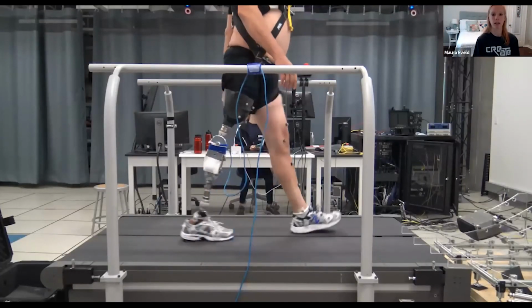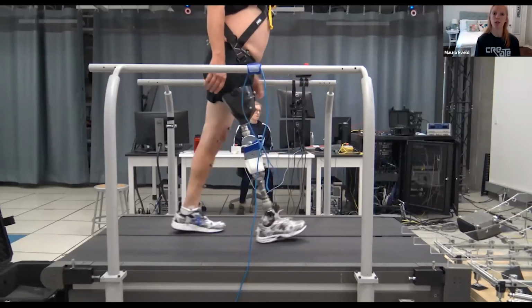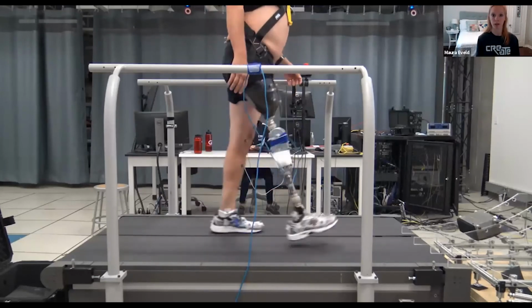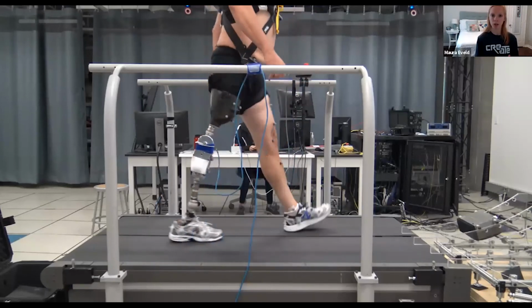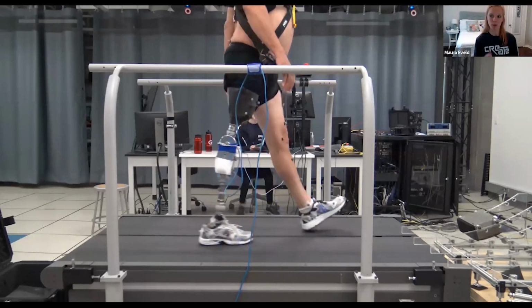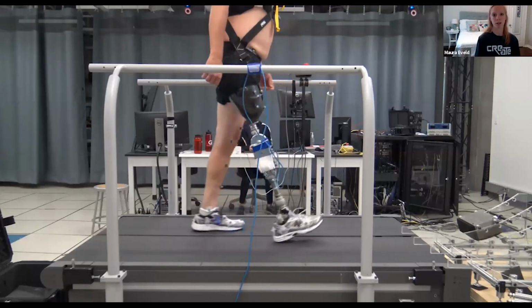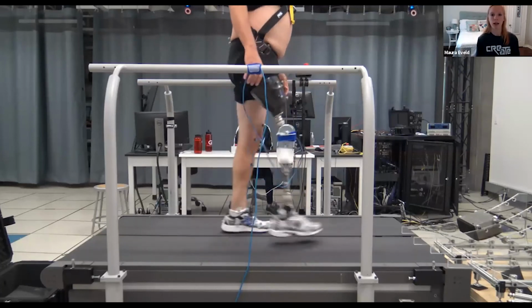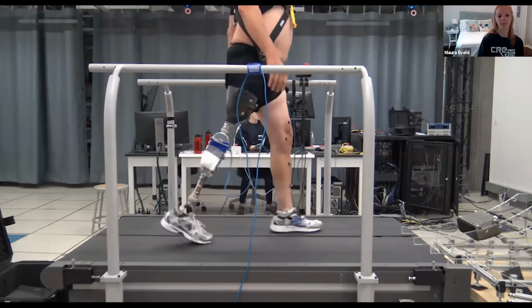This first device here is a lower limb prosthesis. So this assistive device is for individuals who have an amputation above the knee. So they need something that can replace both the knee and the ankle joint function. In this particular device, the knee joint here is powered. So it has a motor that allows for the prosthetic knee to stay straight while the user bears weight on it, but also can flex and extend or bend and straighten when the other foot is on the ground. The ankle joint on this device is unpowered or passive, and so it acts more like a spring to help facilitate the landing and push off of the foot during walking.